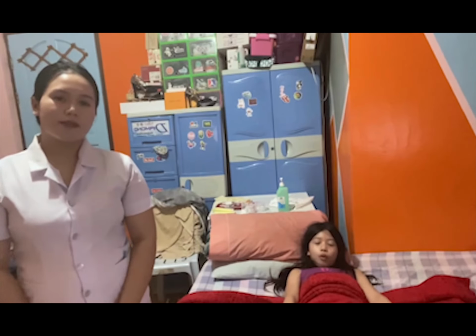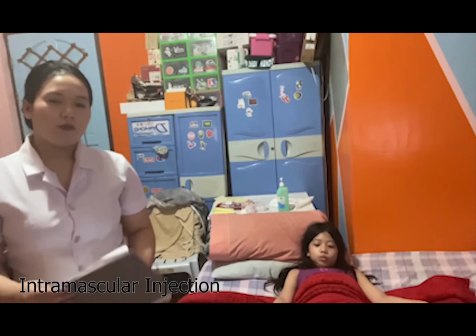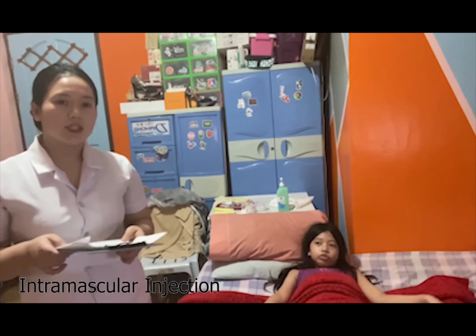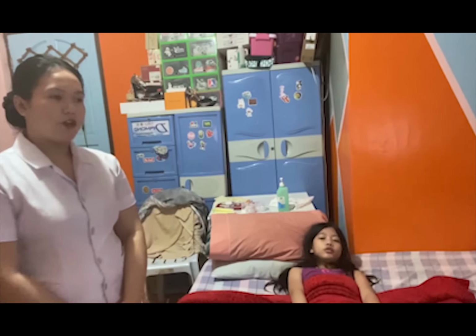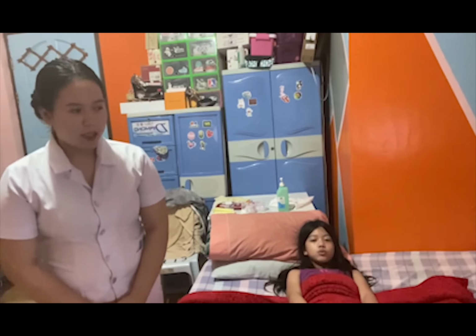So now I'm going to perform the intramuscular injection. So first is check the doctor's order and patient's chart. Then verify your client, then introduce yourself to the client and explain the procedure.